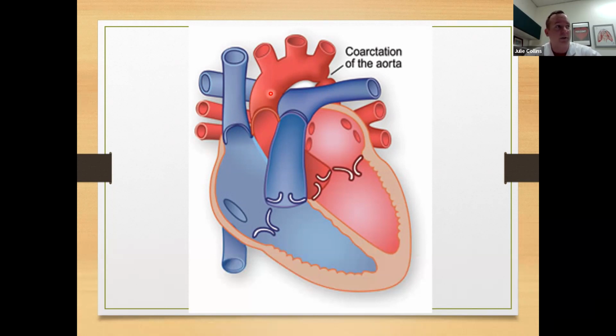On adults, you could definitely get away with left heart bypass, but an adult with a coarc, maybe it's a kid that had balloon dilatation earlier on and ultimately needs a repair. But yeah, left heart bypass is definitely doable here. Does everybody understand what left heart bypass is?